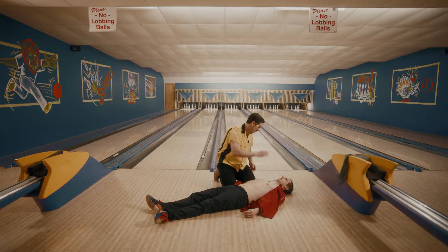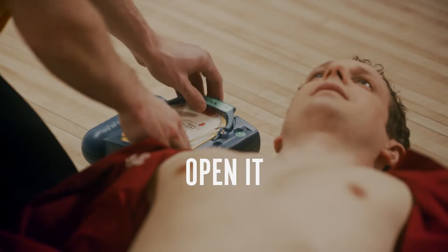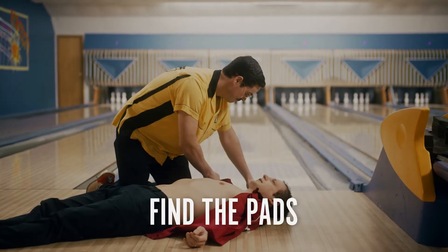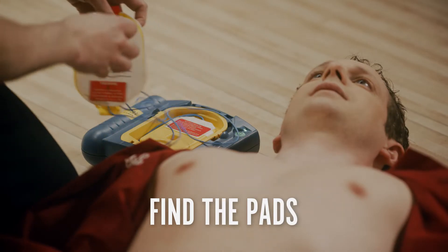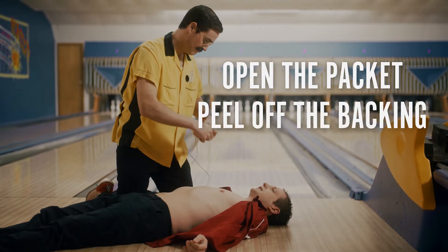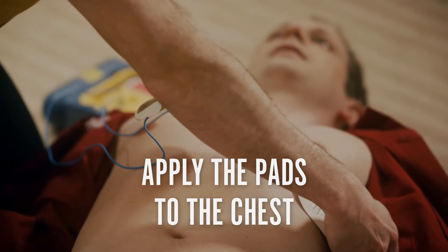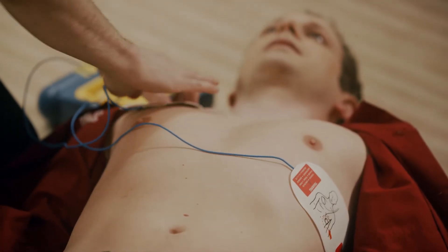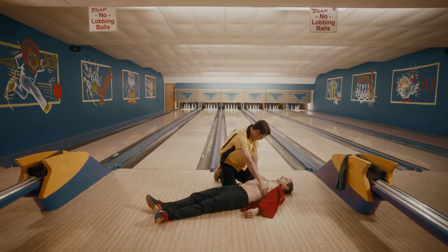Now to operate the AED. Open it and press the on button if there is one. Next, find the pads and plug them in if necessary. Open the packet, peel off the backing and apply the pads to the chest. With the pads securely in place, the AED will now tell you what to do.